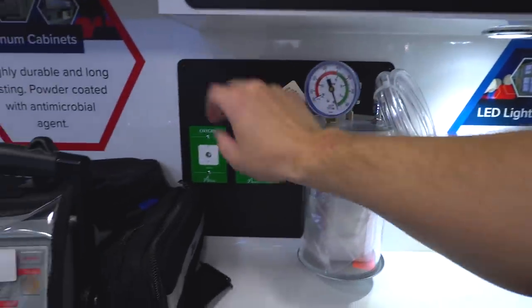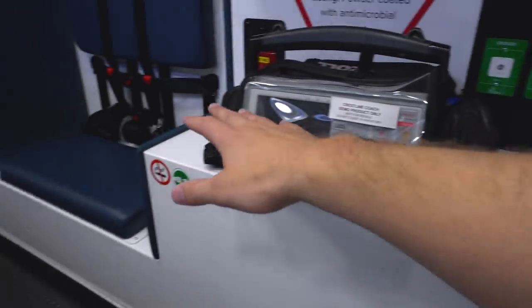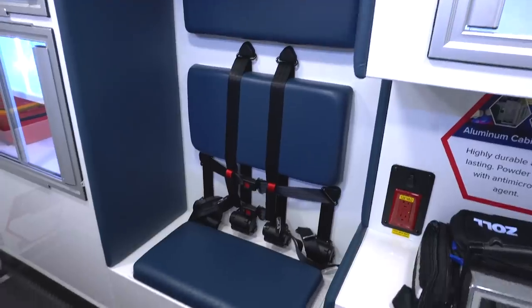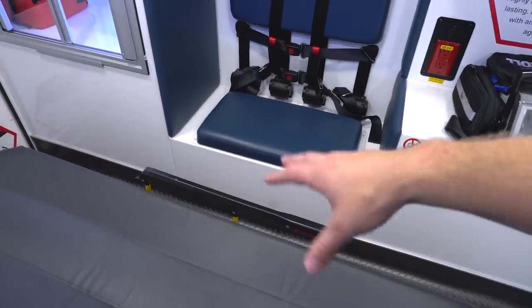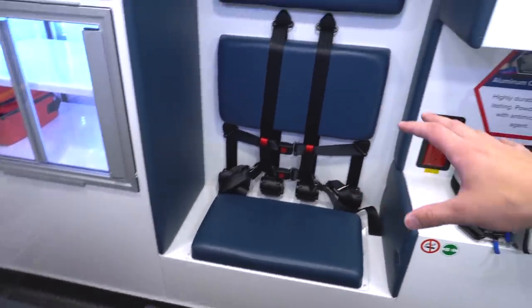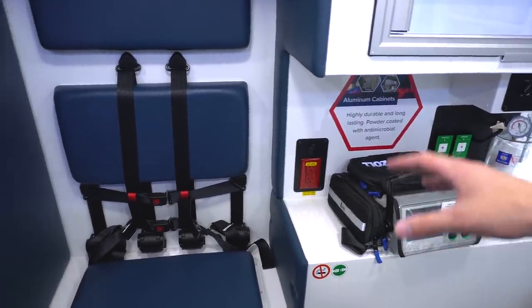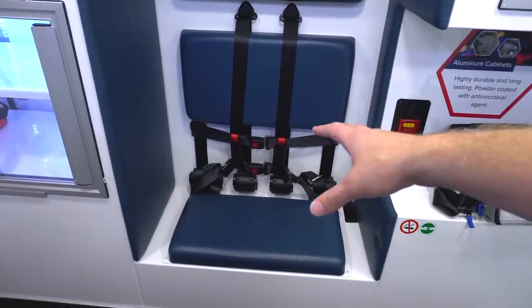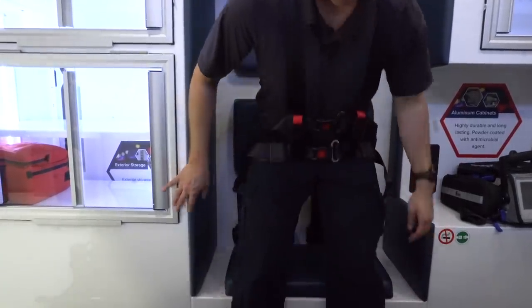Below that you've got your suction unit and oxygen ports. What you'll notice about this entire console is that it's actually a lot longer than in a lot of other rigs, because they've taken the CPR seat and moved it to the actual position for CPR. In other rigs this seat is further up, positioning you closer to the head than the chest, making it hard to do CPR or put on EKGs. This seat is positioned exactly where you need it. You'll also notice the six-point harness, which still allows you to get up out of your seat, do work, and remain safe back here.